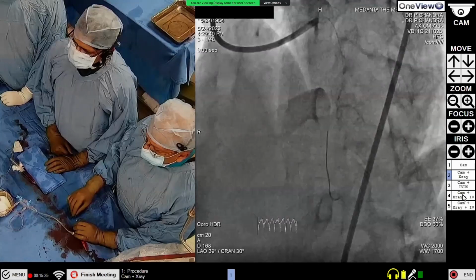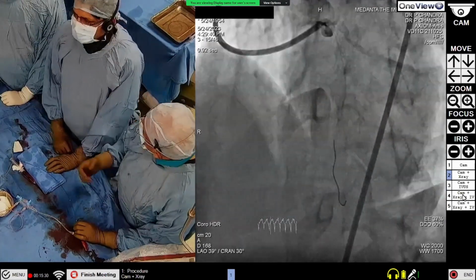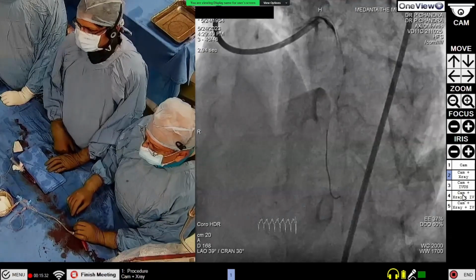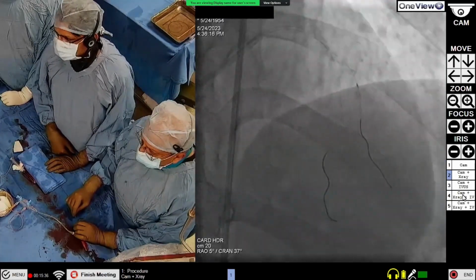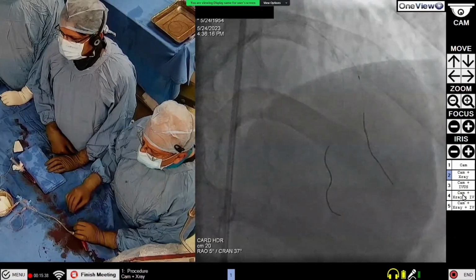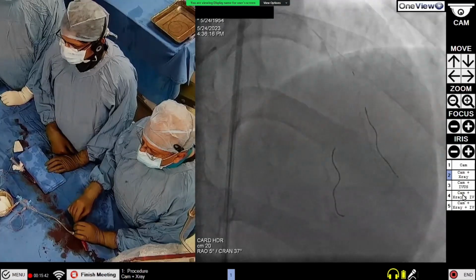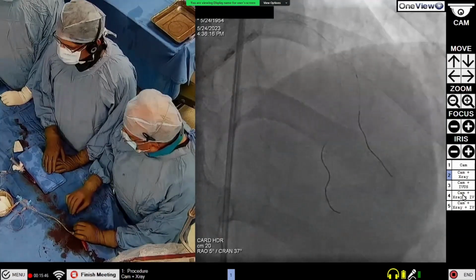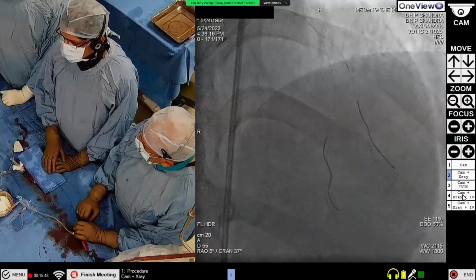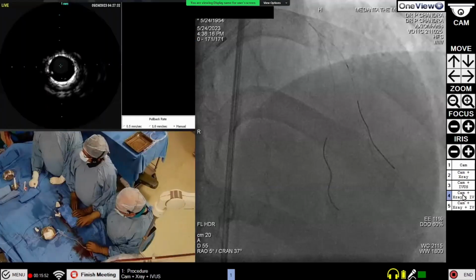Should we go for bifurcation angioplasty with 2 stents, or provisional, or some newer innovation, so that we avoid too much metal in the coronaries? All these options are open till now, and we'll decide as per imaging, FFR and IVUS guidance. There is an FFR bar in the LAD and a normal bar in the diagonal. Now we are going for imaging of the LAD, and on the basis of that we will decide.